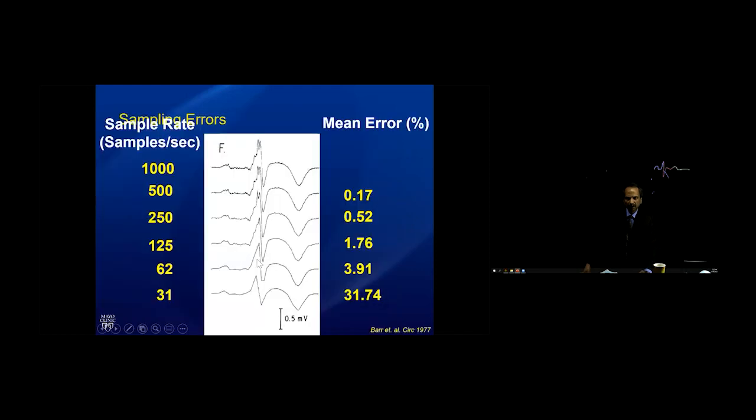Another issue, an allied issue we don't talk about very much, is also the sampling rate, or what's the frame rate for the recording. And many times when fellows are trained and then they're getting a job and people see how great they are, they'll get an offer from their hospital saying, you can build your own lab.